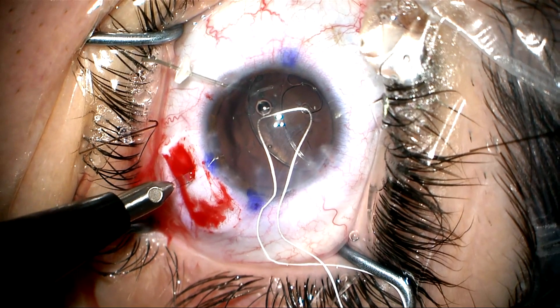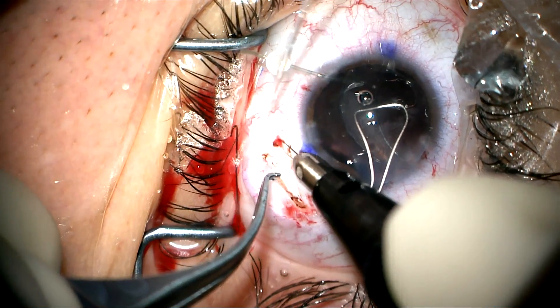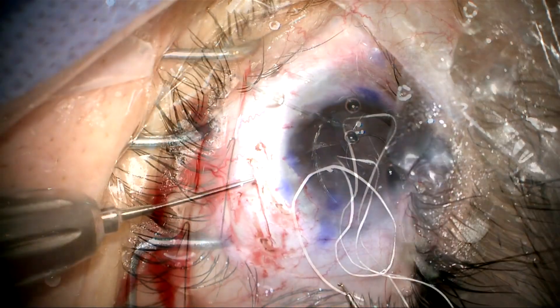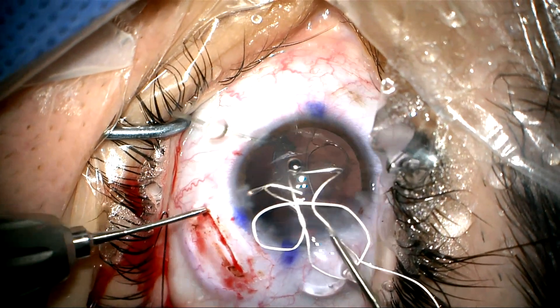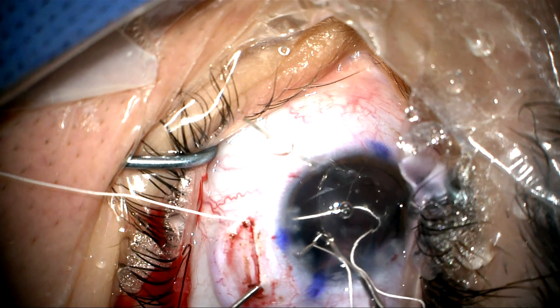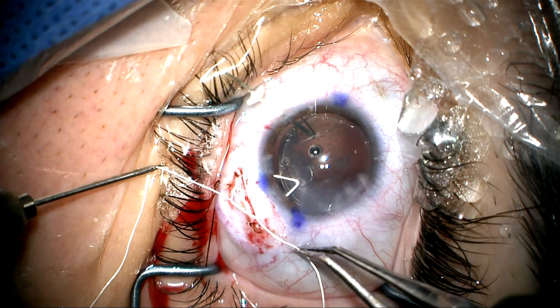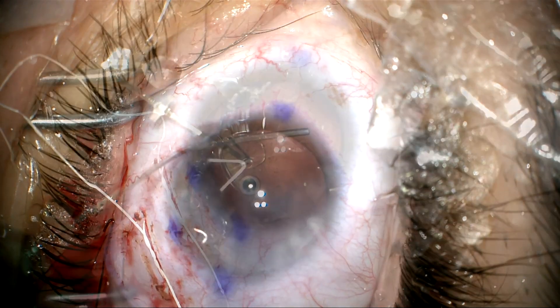We're going to make two sclerotomies and connect them with a scleral groove, placing these on each side of the blue mark where I've determined the capsular bag is weakest. Now I'm undermining the scleral groove to create a little shelf for the Gore-Tex suture to be covered. We'll enter with 25-gauge forceps and grab one end of the suture, keeping track of which end is which to make sure the sutures don't cross. Then we'll grab the other end, being careful not to rupture the anterior hyaloid — staying above that but below the iris plane. We'll do a temporary tie to pull things over and stabilize; we'll go back later and lock that.